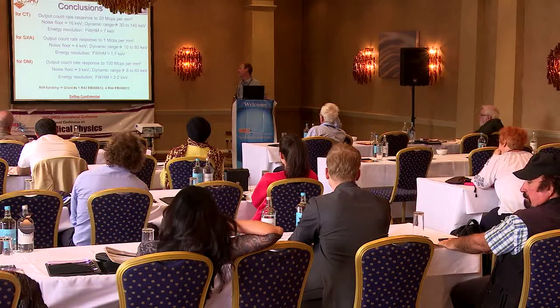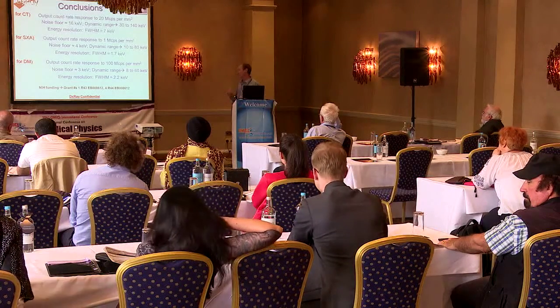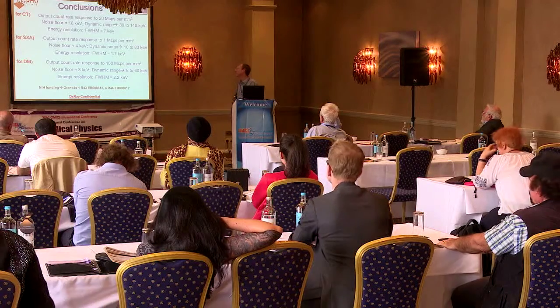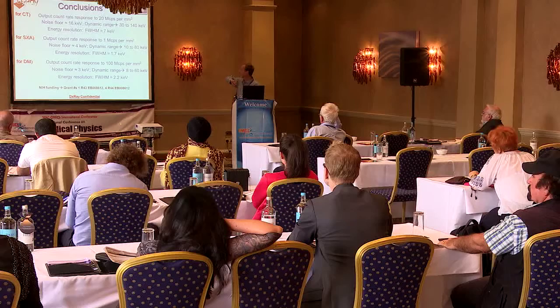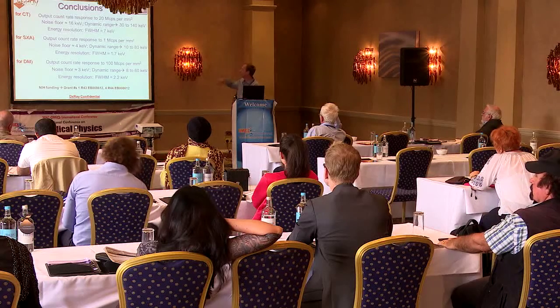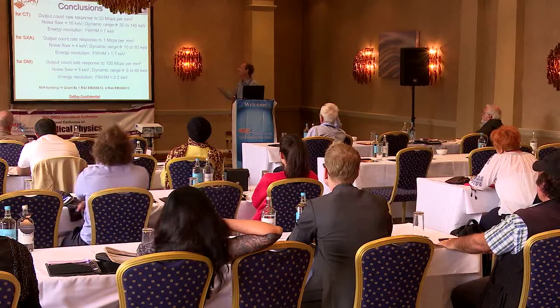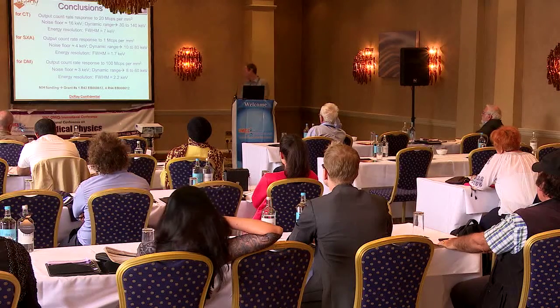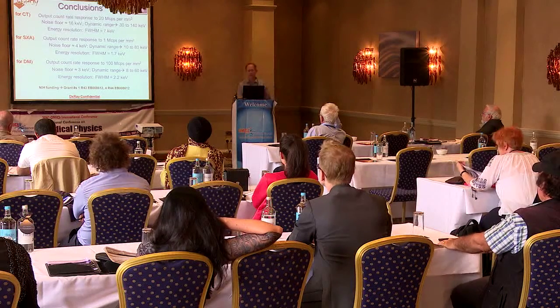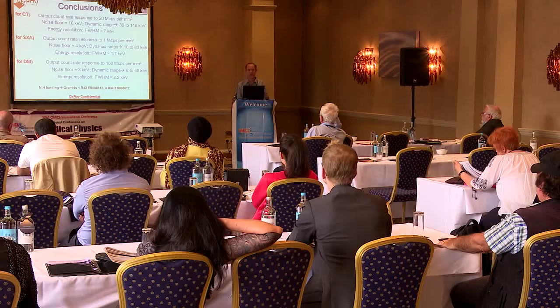And finally, for mammography, we've obtained 100 million counts per square millimeter, a noise floor of 3 keV, a dynamic range between 8 and 60 keV, and an energy resolution of 2.2 keV. The work is funded by NIH grants, and thank you very, very much.